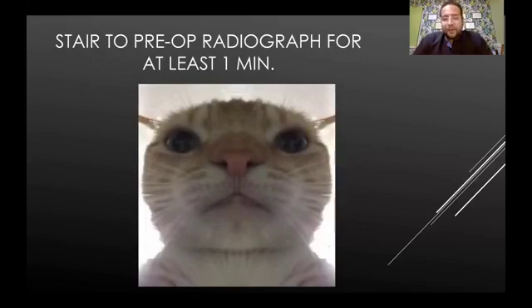Second, one trick that really benefits me along my clinical work is to stare at the radiograph for not less than 1 minute. As time goes, you will discover a lot of things. So just concentrate on your radiograph for 1 minute, even if it's very simple. Don't take a quick look. My trick is to count 1 minute and stare at your radiograph for 1 minute. That's really helpful.